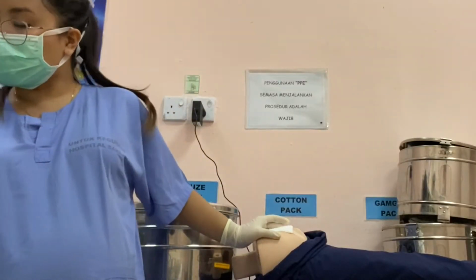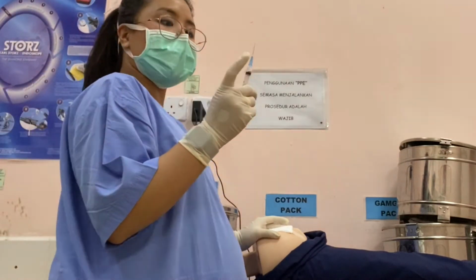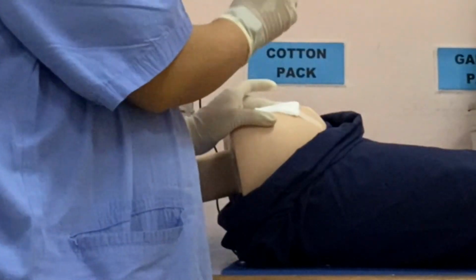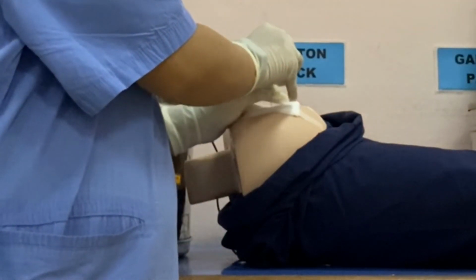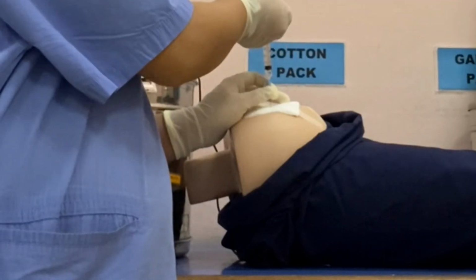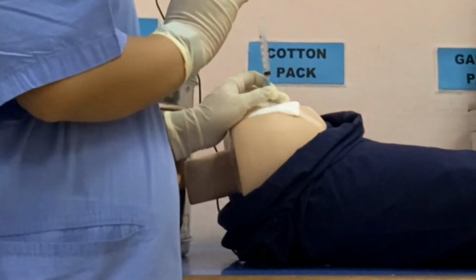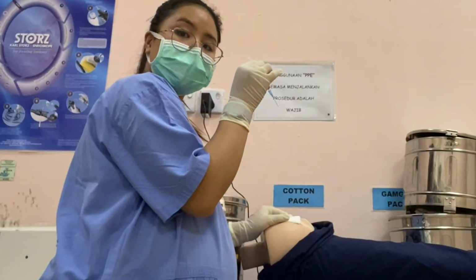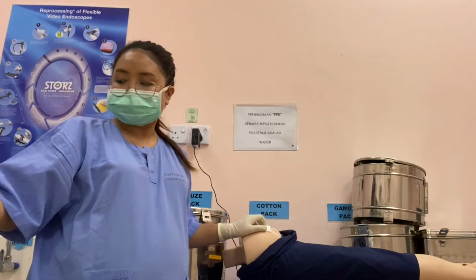Of course, be extra careful with the needle, which already has medication inside. Poke at 90°, withdraw the plunger to see any blood. If there's no blood, you can inject the medication, wait for 1 to 2 seconds, and then take out the needle and throw it in a sharp bin.